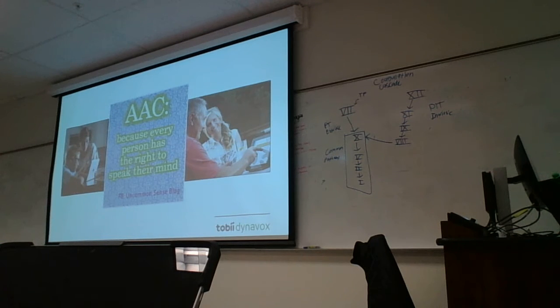Okay. So AAC, our jobs as speech therapists, we want people to be able to communicate beyond their wants and needs, be able to advocate for themselves. We'll talk about different types of access. So we do have the different types of communication programs, such as Communicator 5, Snap Core First, but there's also access to the devices outside of the communication software. So on the newest devices, we have what's called computer control. What that allows you to do is use the desktop on the Windows-based device, just as you would with a keyboard and mouse, but you're using your eyes to do that. So we'll be able to take a look at that on the iSeries devices.